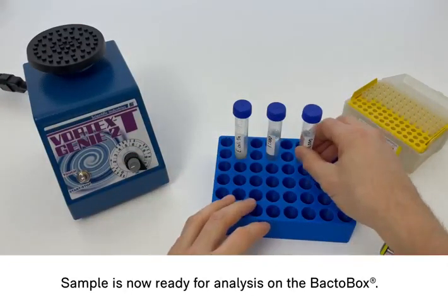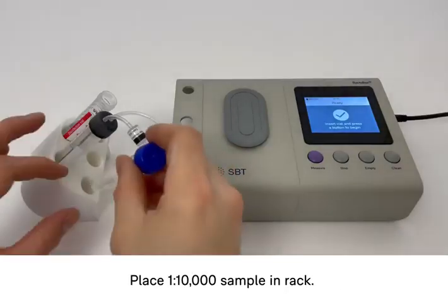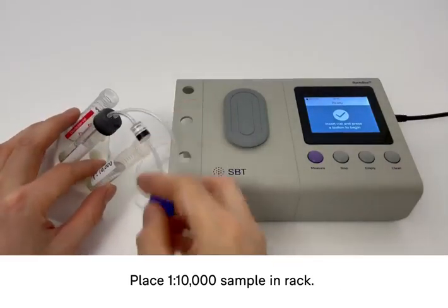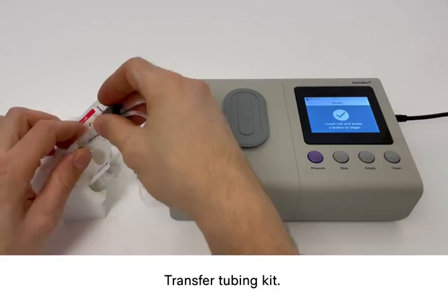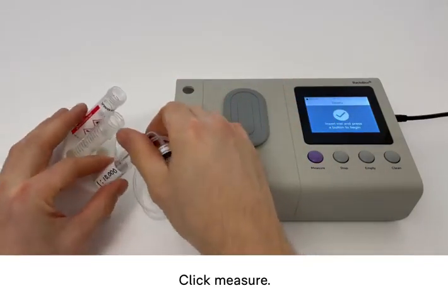The sample is now ready for analysis on the BactoBox. Place the 1 to 10,000 sample in the rack, transfer the tubing kit and click measure.